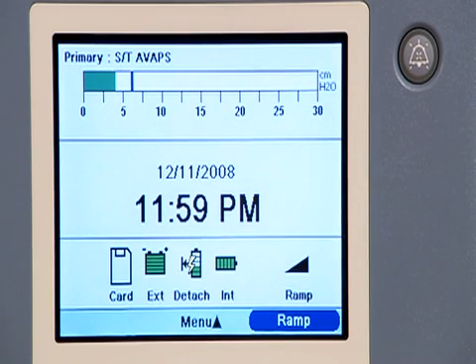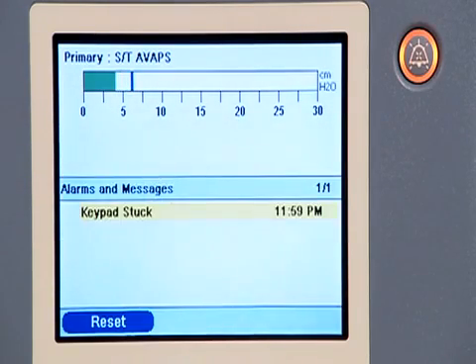Trilogy100 also has a number of low priority alarms, which convey information that you should be aware of. For example, a button is stuck, or the detachable battery needs to be charged. Low priority alarms are 2 beeps together in a repeating pattern. The audio pause button shows a solid yellow light. The alarm message is highlighted in yellow.